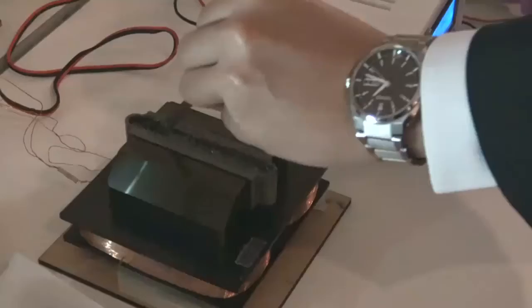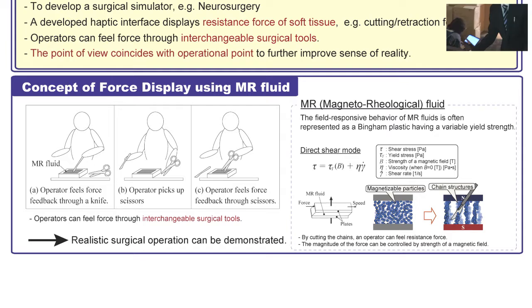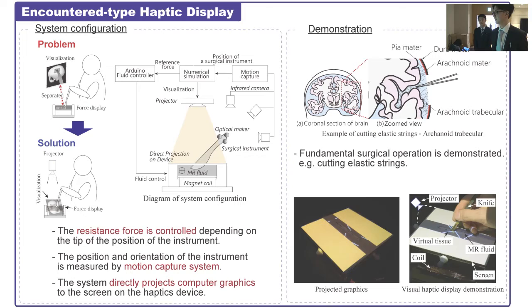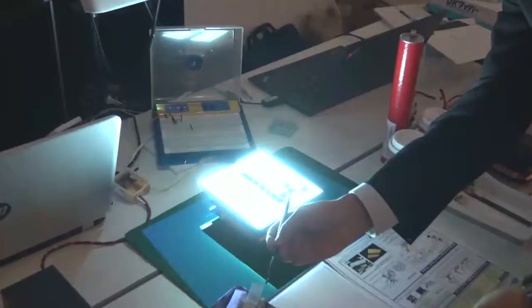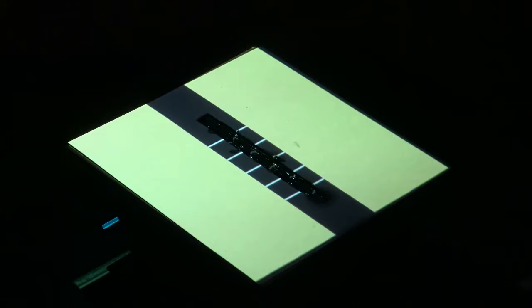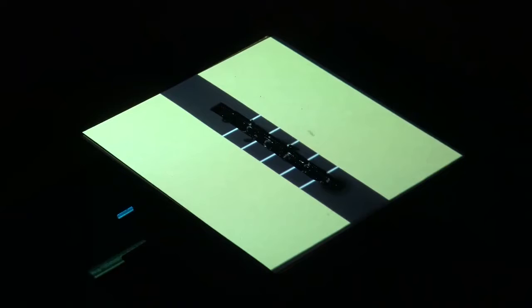The advantage of this device is that it can use real surgical instruments and move freely. We propose a new type of visual haptic display. The system mainly consists of a numerical simulation and motion capture system, and a haptic interface using MR fluid and a projector. It projects the computer graphics to the screen on the haptic device directly.